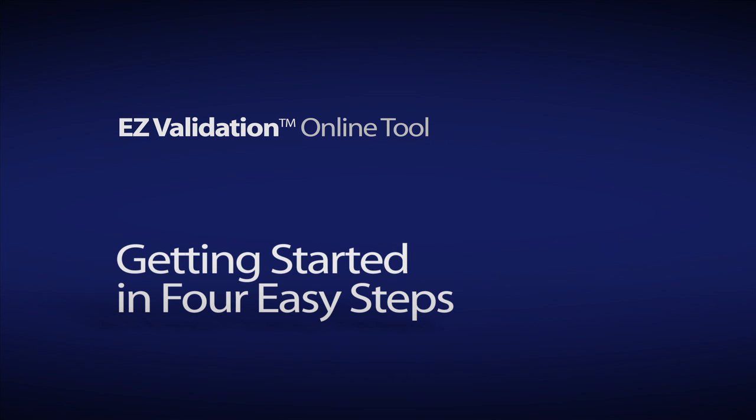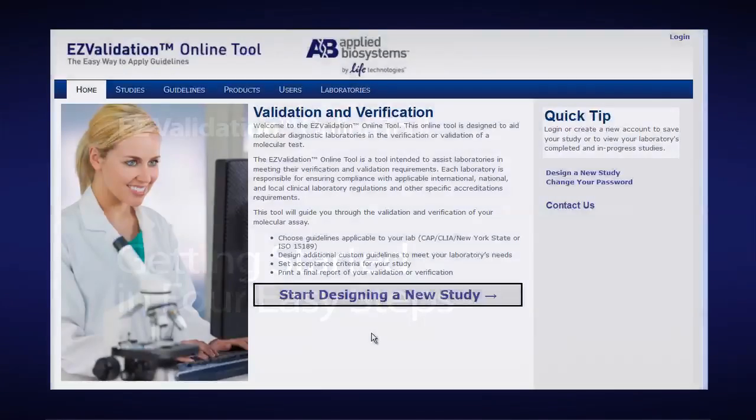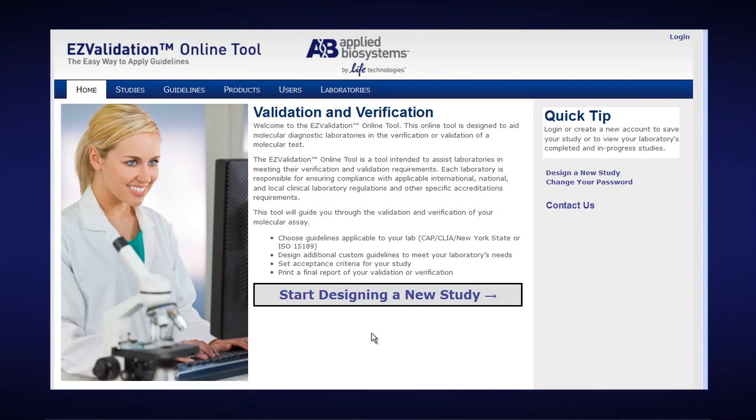Welcome to the EZ Validation online tool video. This online tool is designed to aid clinical laboratories in the verification or validation of a molecular test.